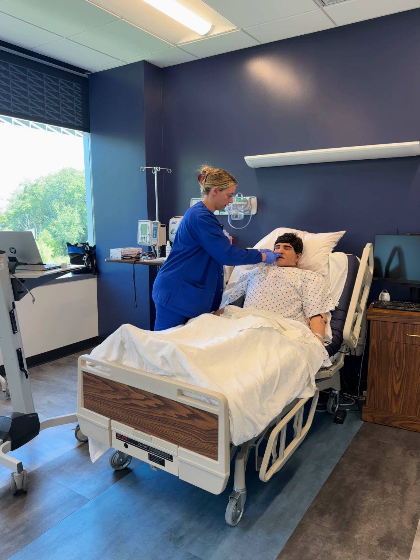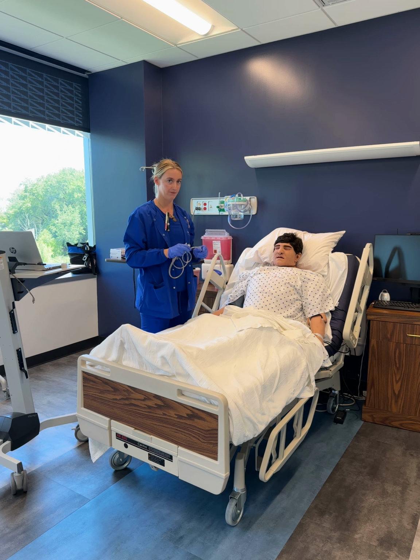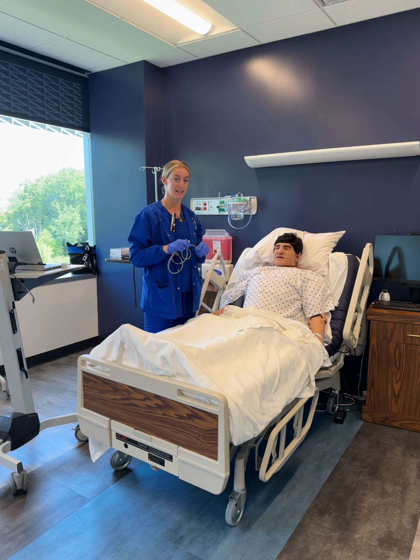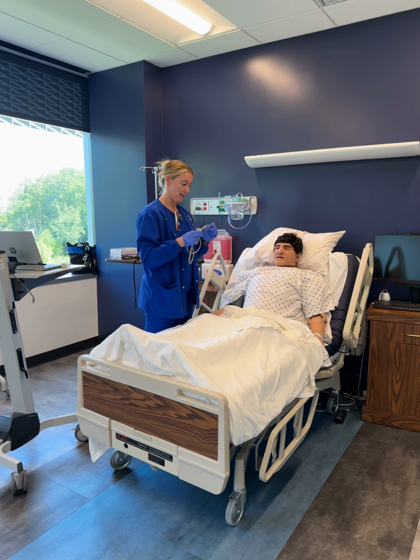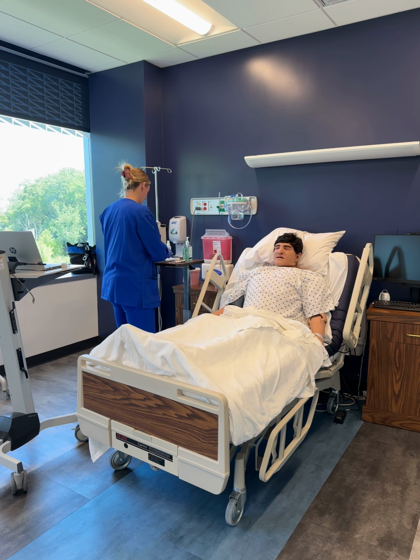I'm pulling the NG tube out, making sure the NG tube is intact. Self-identifiable break number 1 for the removal. I am going to kink clamp in before pulling out the NG tube. The NG tube is intact. I'm going to discard all of my items.